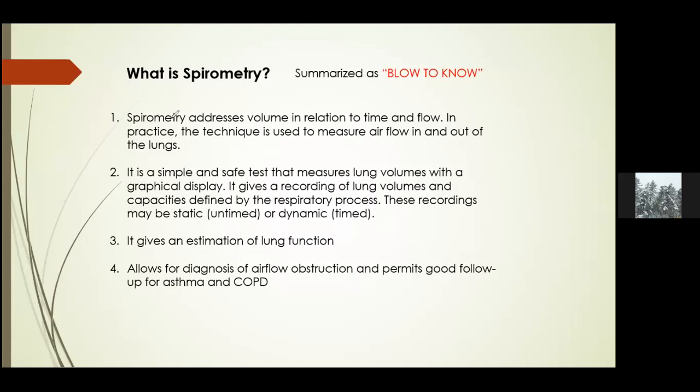Secondly, after you know how much volume of air comes in and goes out, there are two components that you can measure. You can look at the amount of air regardless of how much time you take to move in the air. What does that mean? Right now, if I told you to just take in a breath, take in so much air as much as you can, some people may decide to gasp up the air at a very fast rate.